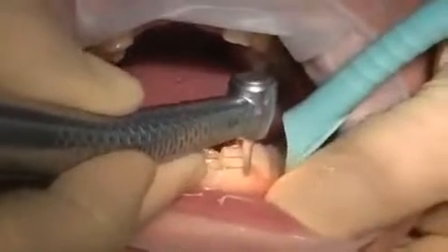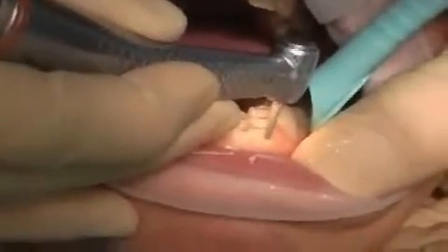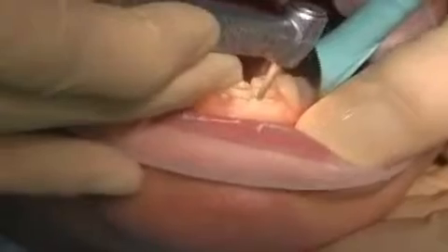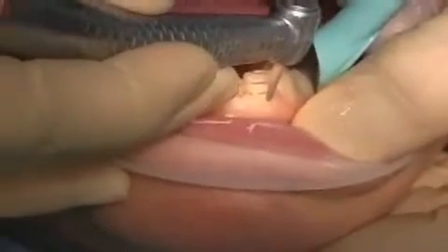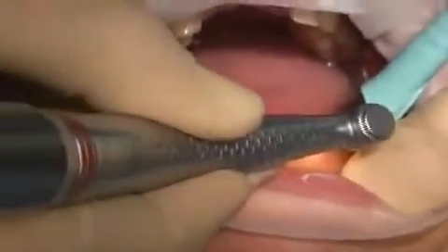A thin layer, 0.3 to 1 millimeter, is removed from the enamel as needed. This preparation is done according to anatomical conditions, and the goal is to achieve a cosmetically attractive, long-lasting result. Special depth marks, the dark lines, show the dentist how much enamel he needs to remove.